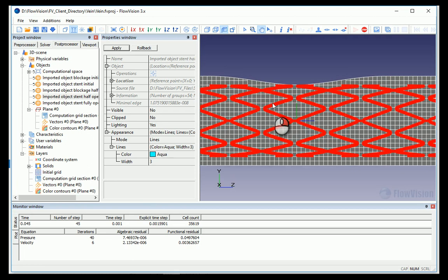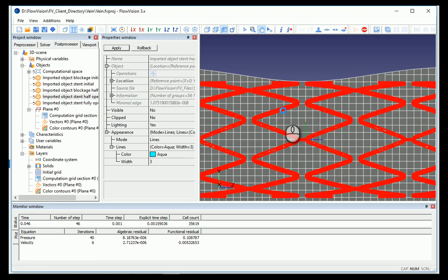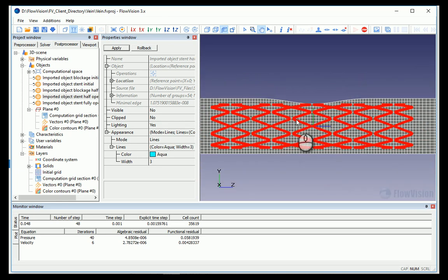So this is being done automatically, and the flow field is superposed automatically once one geometry is deactivated and disappears and the other comes into action. This is the idea here.